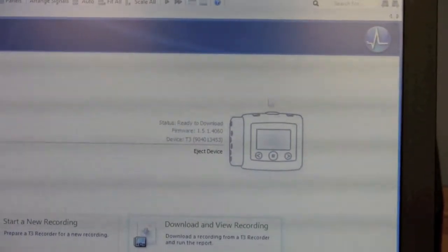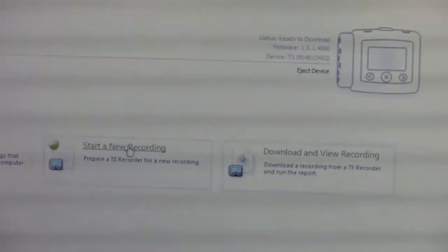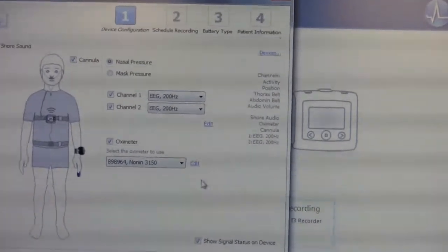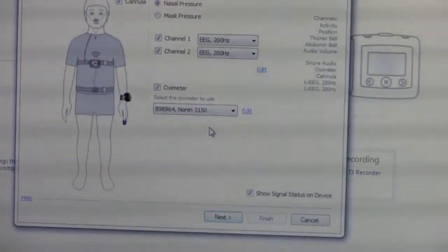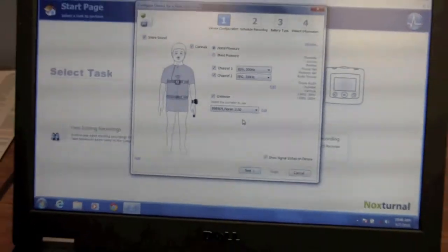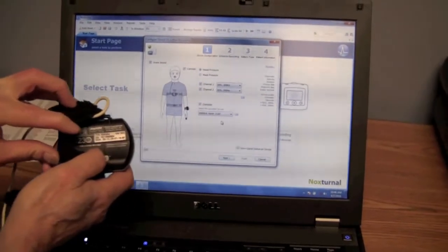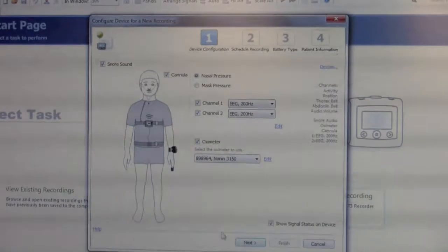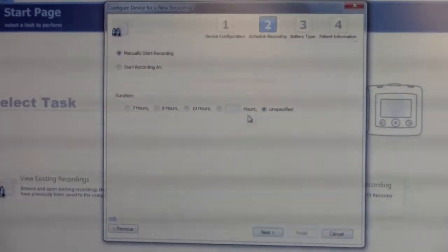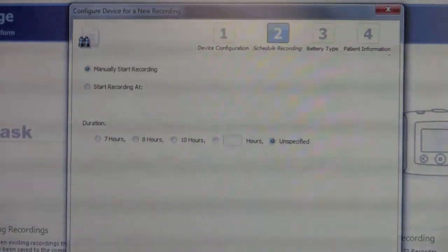Now that we have our monitor connected, we're going to start a new recording in preparation for our patient's visit. This screen shows that all your parts and pieces are connected. The first time through, you will need to add the pin number of the pulse oximeter that you're using. Once you've connected the pin number to the software, click Next. We're going to have the patient manually start the recording — you could do it automatically, but it's a little easier for patients if you allow them to do it manually.